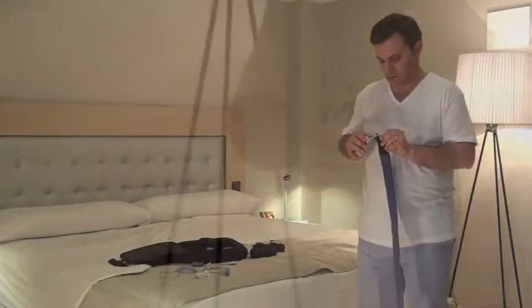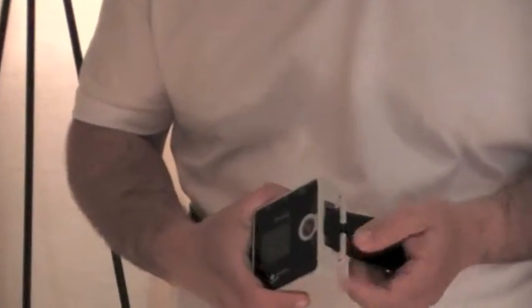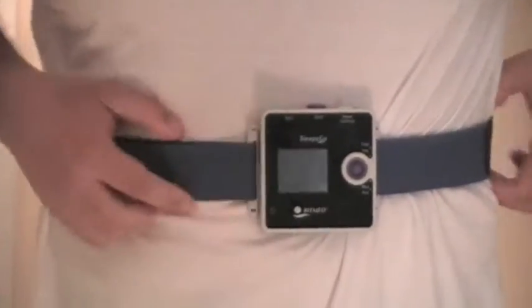Pass the unit's subjection belt through the side of the slip-and-go polygraph, folding and placing it on itself. Afterwards, place the device center between the abdomen and the thorax. Place the band around the body and finally pass the other end of the band through the other side of the device and fix it so it's firmly adjusted.